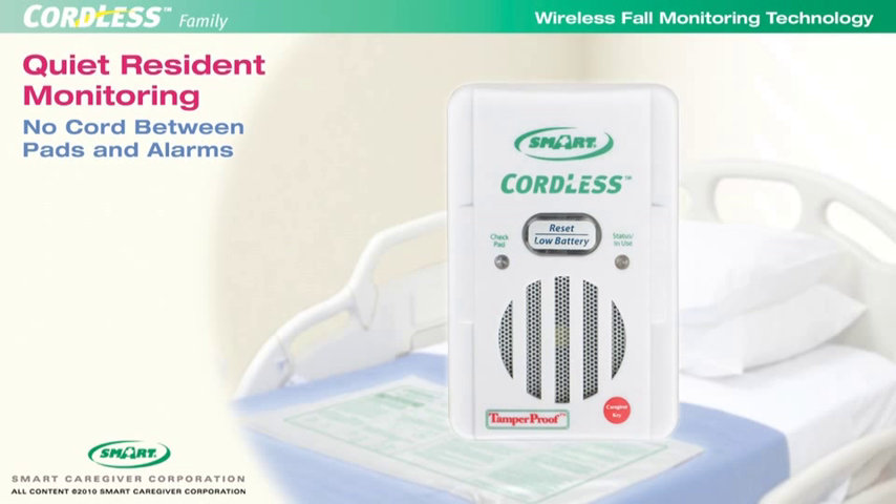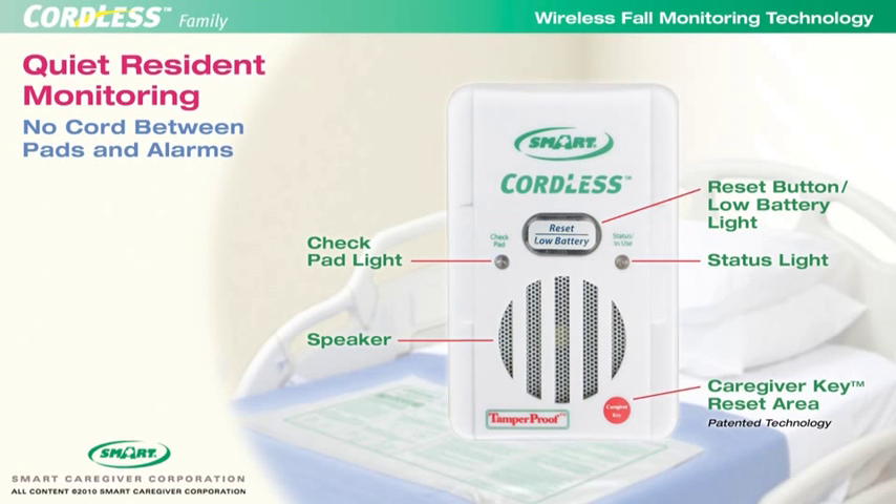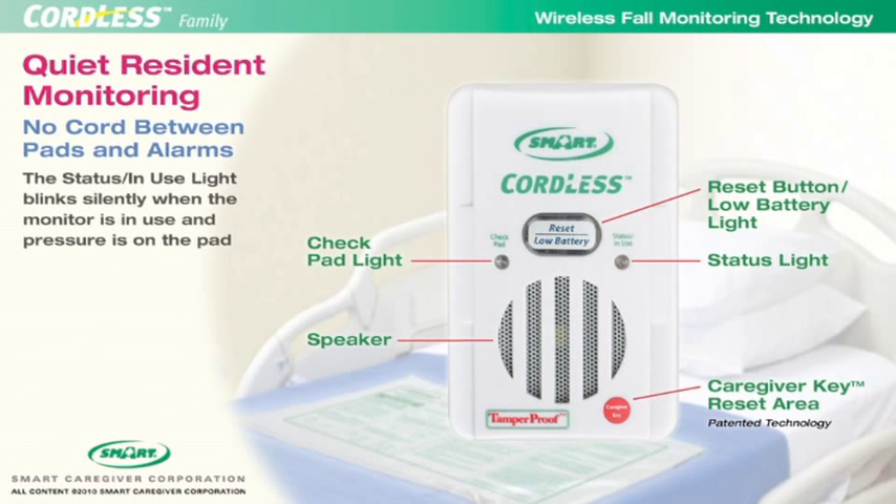Let's start by looking at the external features of the Cordless Fall Monitor. The main item on the front of the monitor is the large reset button, which also functions as a low battery indicator. To the left of the reset button is the check pad light, and to the right is the status in use light. Below those indicator lights is the speaker, and below that to the right is the caregiver key reset area.